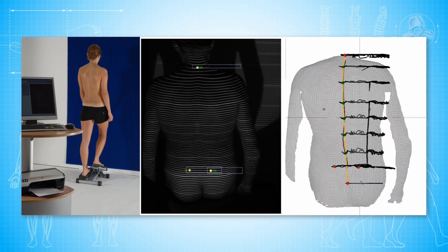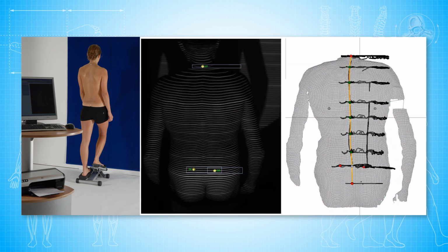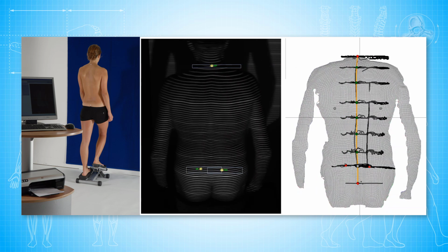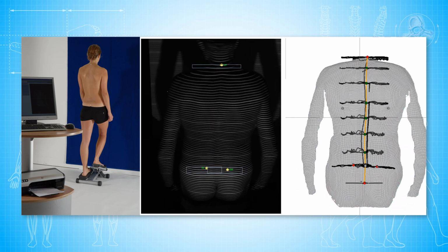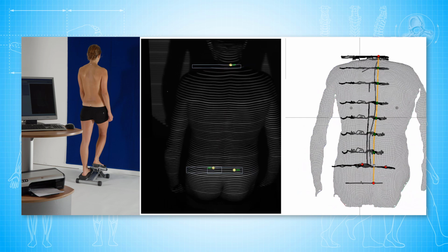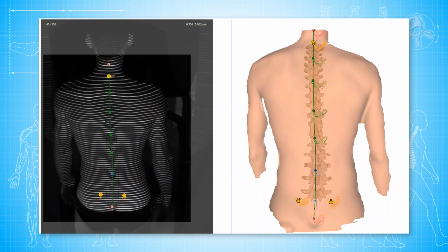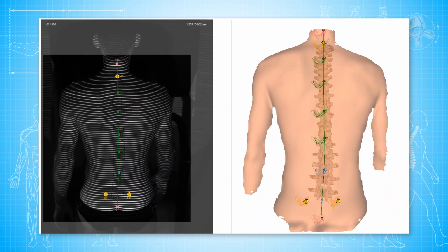Unfortunately, the capacities of the recording units via the then prevailing USB 2 standard were quite limited. Computer performance was also not capable of showing a 3D model of the torso in fluid motion. It was not until the introduction of high-frequency recording systems at the end of the 2000s that the well-known examination type 4D motion could be introduced to the clinical user market.